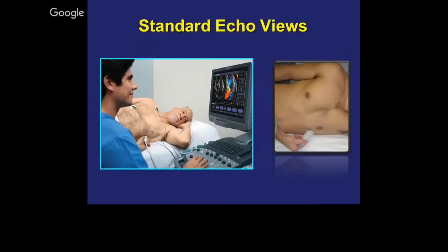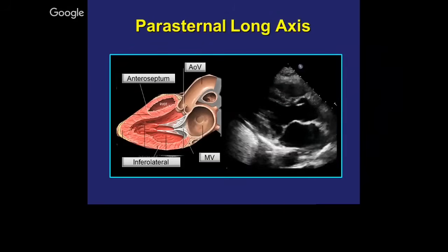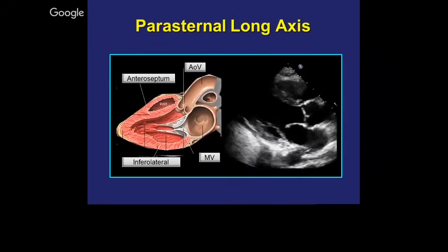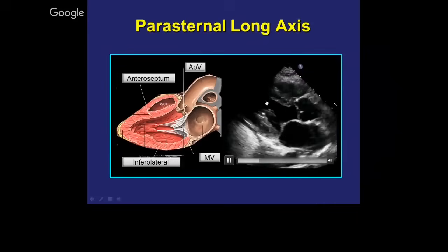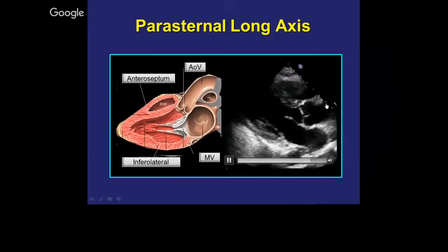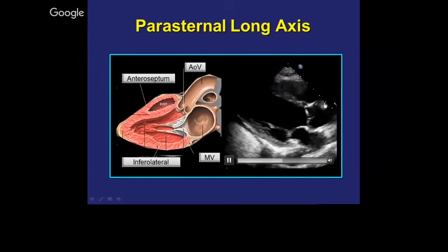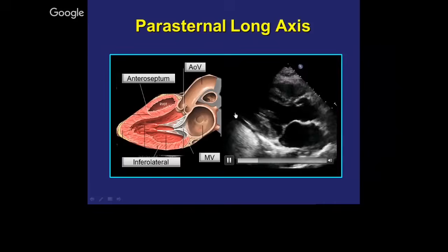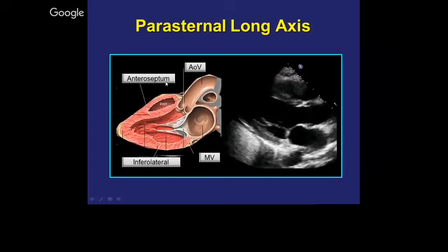This is just to show you the standard ECHO views with the regular transthoracic ECHO. This is the parasternal long axis view, showing the long axis of the left ventricle with the mitral valve here and the aortic valve here, and this is the ascending aorta. We see a little bit of the right ventricle and those are the walls that we're looking at on the left side.